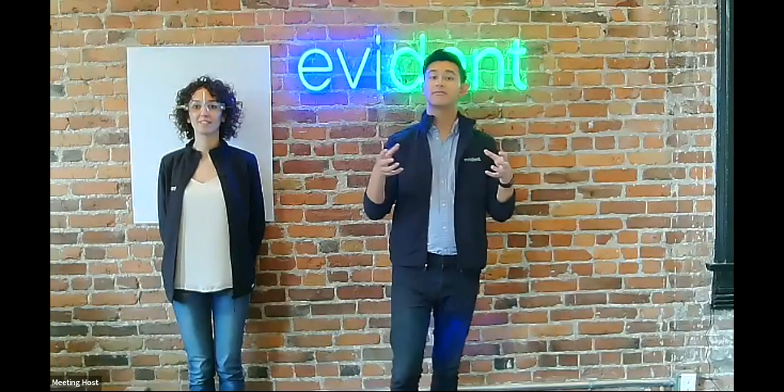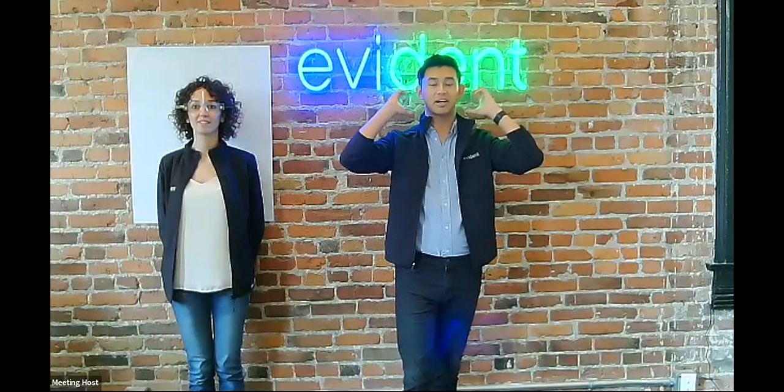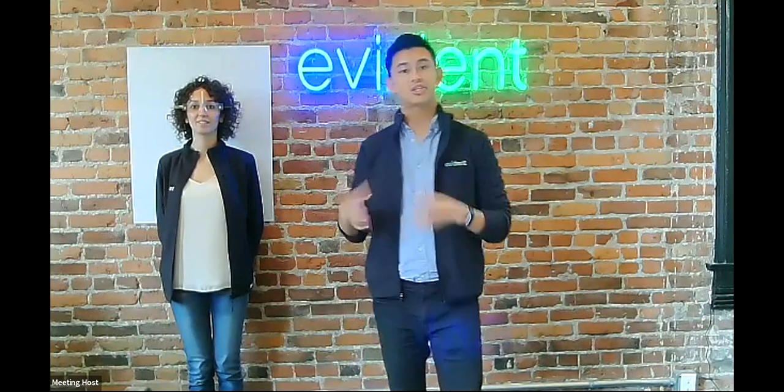But if you even have a foam cylinder, you can also put it behind their neck and they can lean against that. Another great way is if you have a tripod, you can put your camera on the tripod and then you don't have to worry about moving the camera. It'll stay in the same position. However, we do understand that not everyone has a tripod or a camera like that, or they don't even have a foam cylinder.